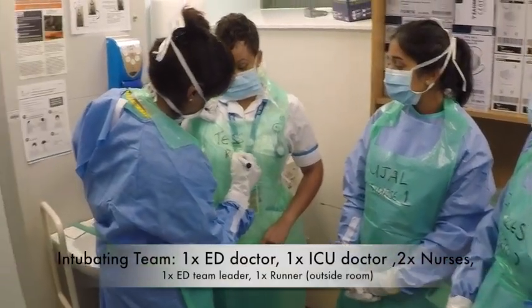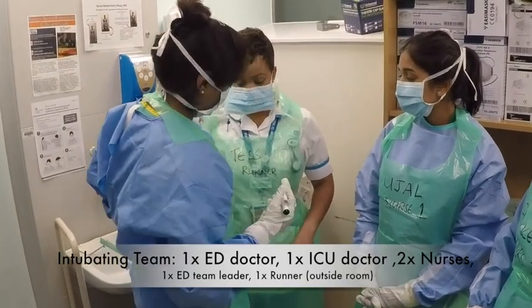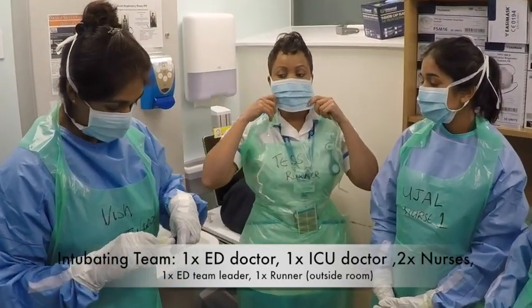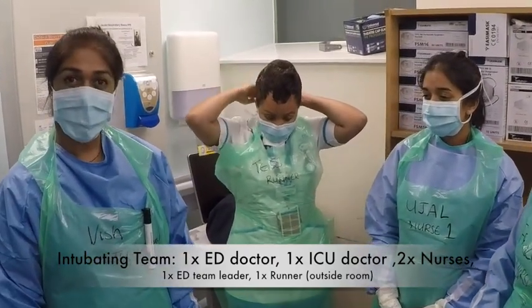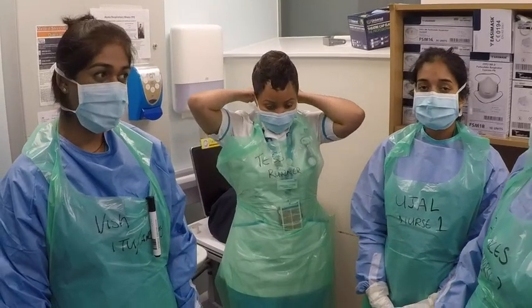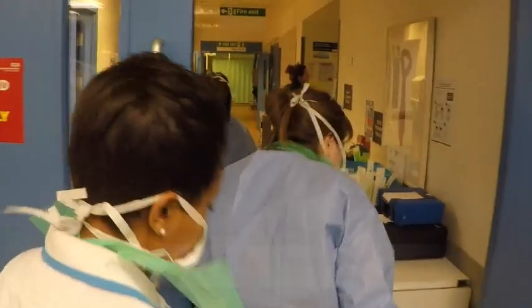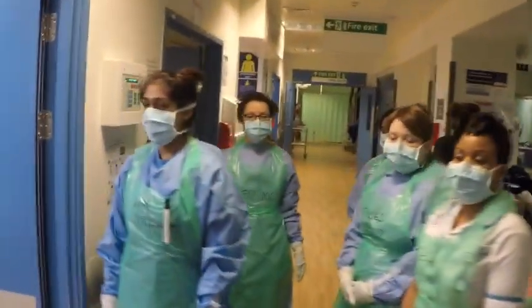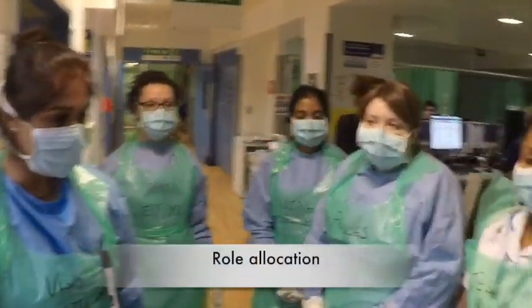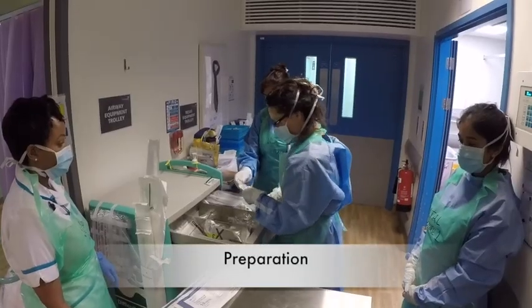The team is going to consist of one ED doctor, one ITU doctor, and two ED nurses — all wearing full aerosol generating PPE. Further to that, there will be an ED team leader and a runner who will be in flu PPE and will remain outside the resuscitation room. With PPE donned and checked, the team members move into the resuscitation area. The team leader will then check that everyone fully understands their roles, and the team will start to prepare to receive the patient.